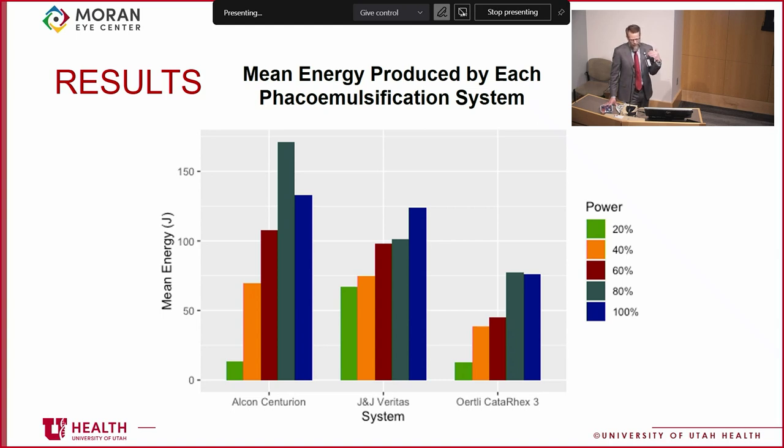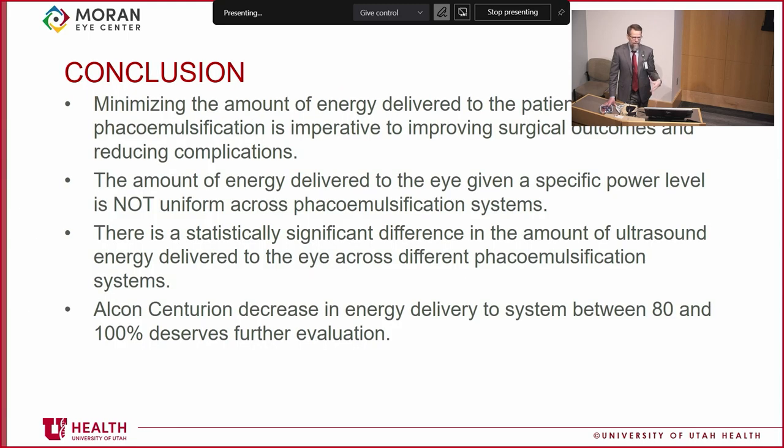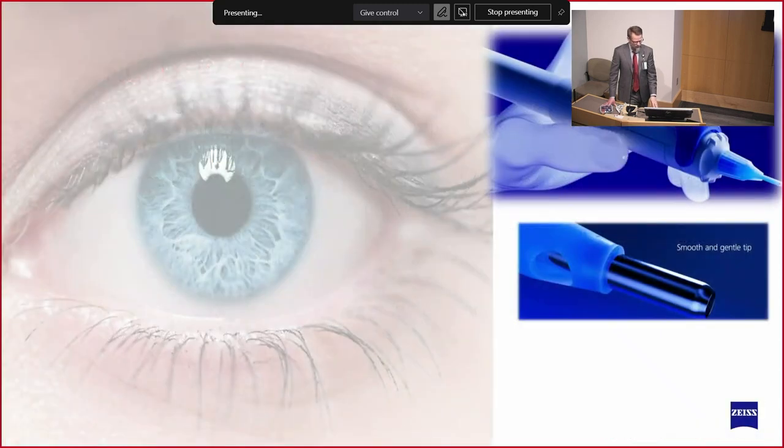They were all done with longitudinal phaco, so on some level, the true apples-to-apples comparison, a little bit of interesting variability in the 80% to the 100% torsional energy delivery with the Alcon, which we're going to look at. But what we've shown through this and then another series is the amount of energy delivered to the eye certainly doesn't always correlate to the CDE number. But yet we also know that the amount of energy delivery to the eye isn't the only variable that's important. And what does that mean, and why are we talking about this?